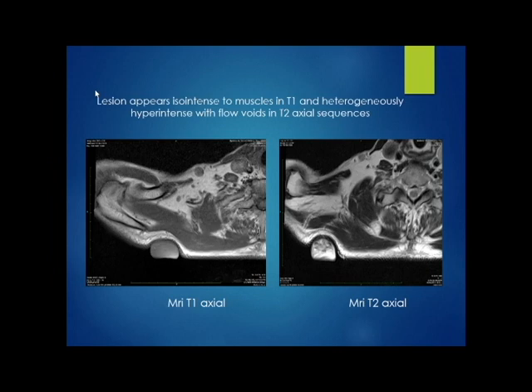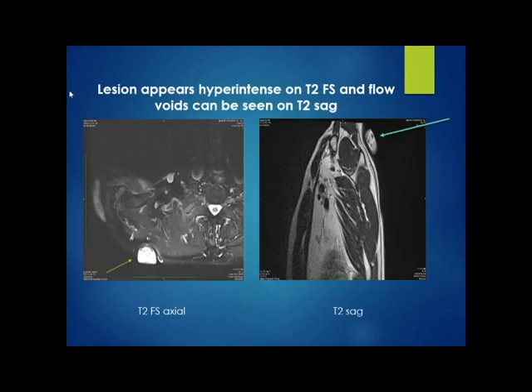On MRI, the lesion appears iso-intense to muscles in T1 axial and heterogeneously hyper-intense with flow voids in T2 axial sequences. The lesion appears hyper-intense on T2 fat sat images and flow voids can be seen on T2 sagittal images.